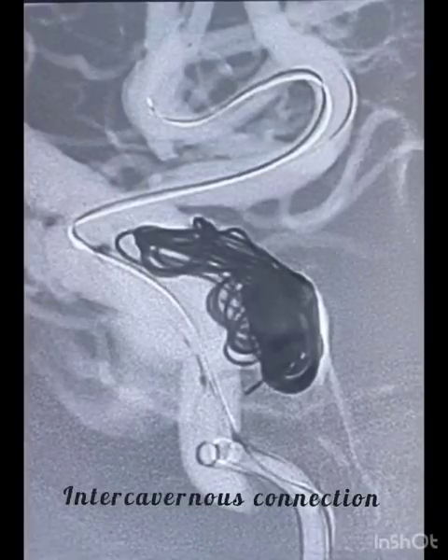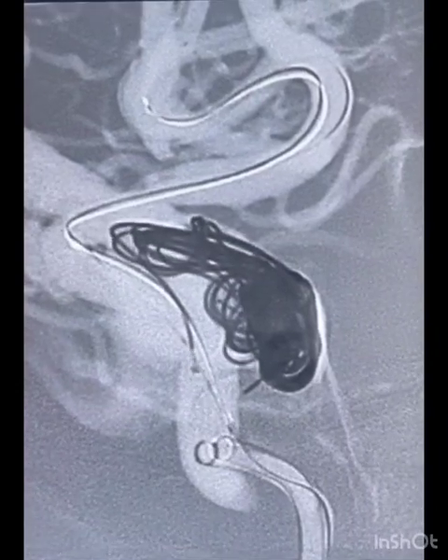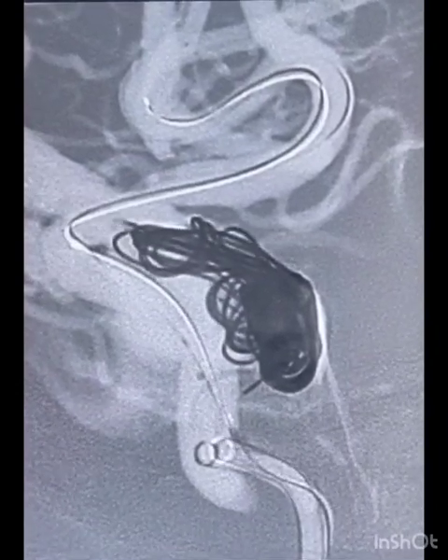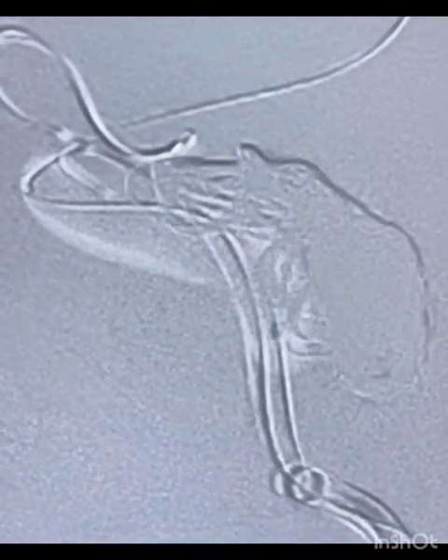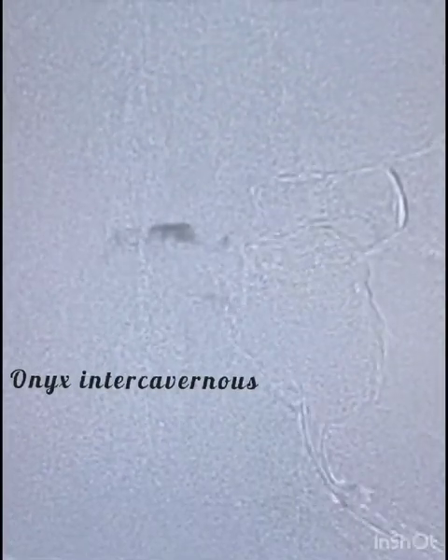Following that, large diameter coils were deployed into the posterior sac sequentially. Following that, Onyx was injected under biplane fluoroscopy with balloon inflation to avoid Onyx reflux into the parent artery. Note the spread of Onyx in the intercavernous sinus.